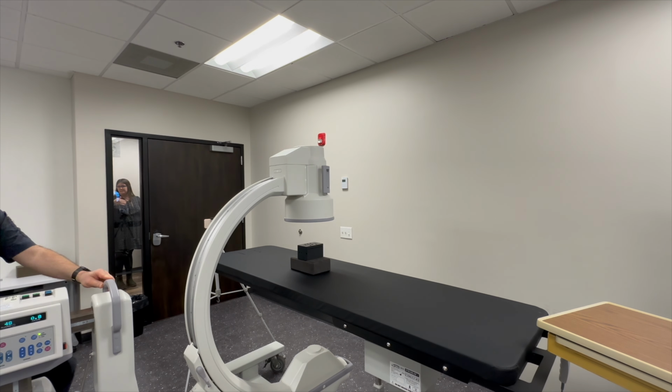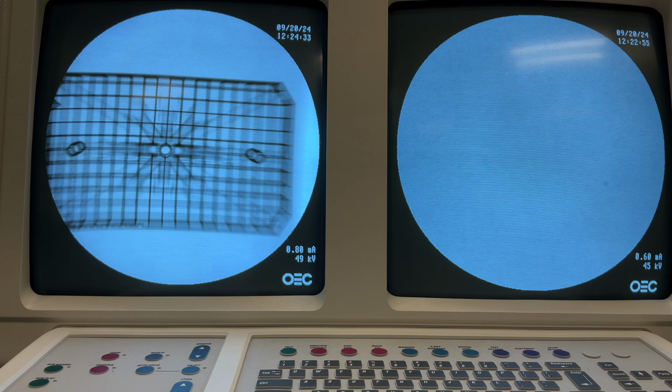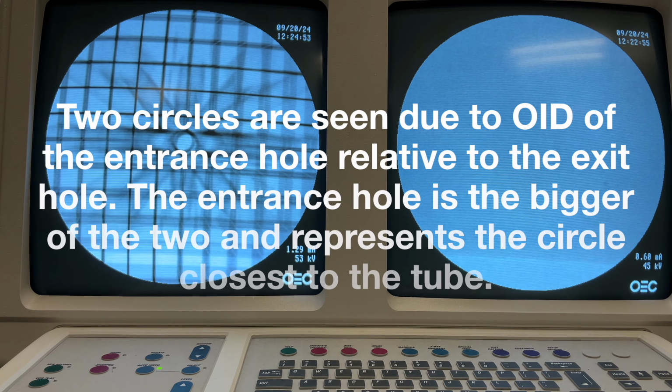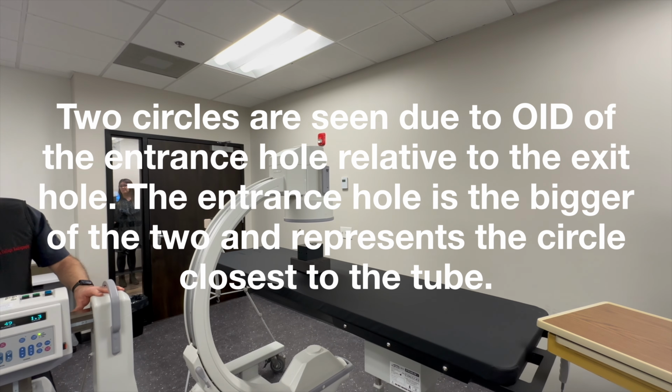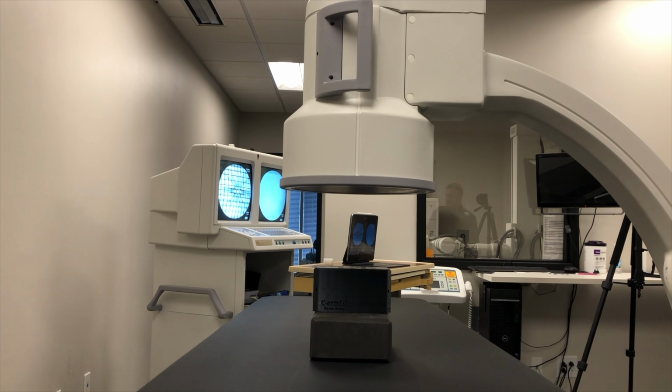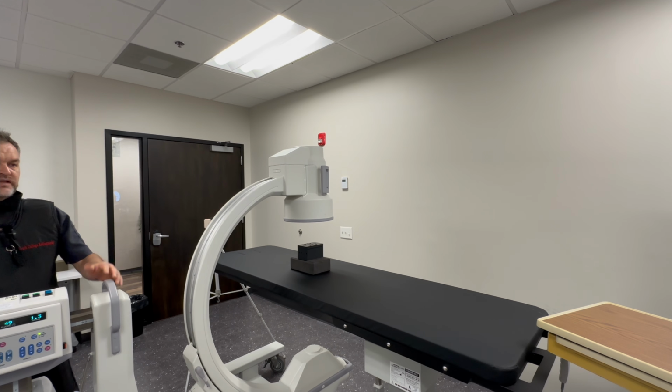So now that I'm hopefully locked in there, I will mag up, and I'm using mag 2 for this. So let's take an image there. So you can see here that the circle is almost in the center. I will pull back ever so slightly, and I also have to move the circle ever so slightly up. So again, microscopic movements that you probably can't really tell too much. So as I'm keying it into the center, I will take another picture.